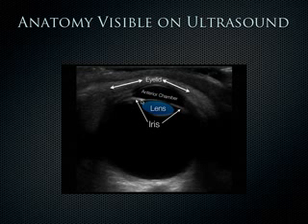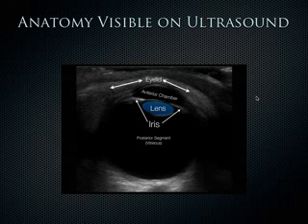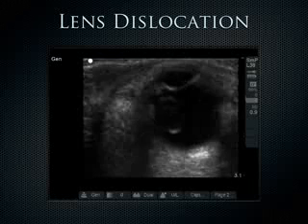And so what happens is when you shine light in the other eye, the eye that's open, you can actually see this iris constrict. And the pupil will constrict because this structure here and this structure here will move towards one another. And then you want to look in the posterior segment, sometimes called the vitreous body, or posterior segment of the eye, vitreous humor, and then behind that is the retina attached down at the choroid. And actually behind the retina, you can see a little piece here of the optic nerve sheath coming down as well.